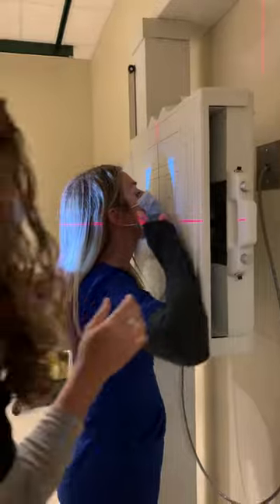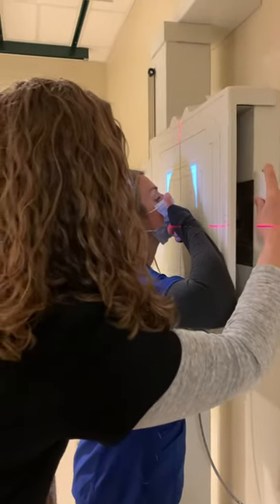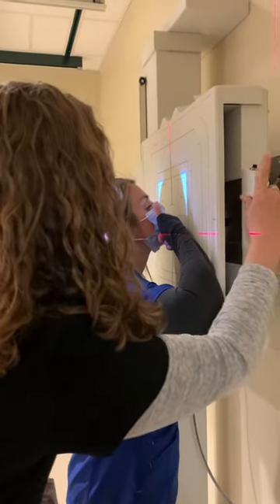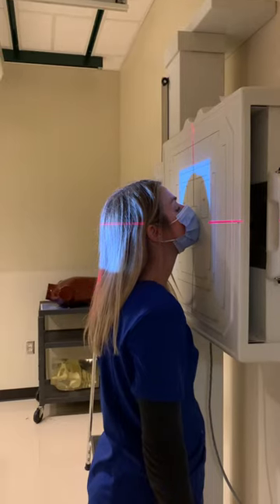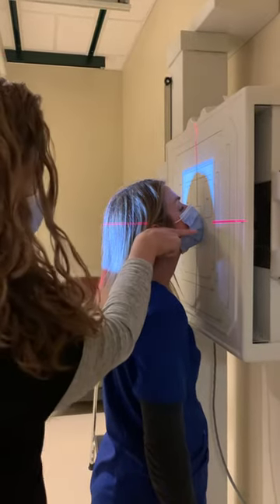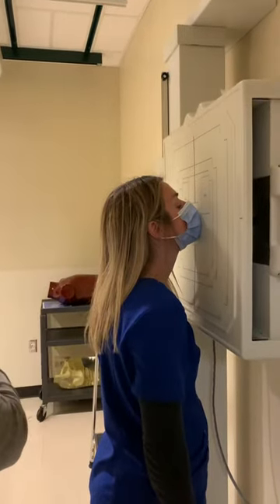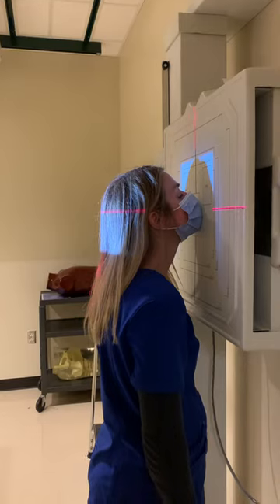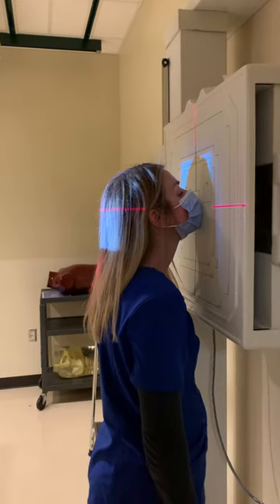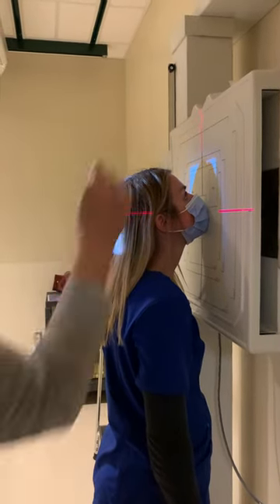We need our OML at 37 degrees to the image receptor, which will put your MML perpendicular to the IR. The central ray is perpendicular, and we're going to exit at the acanthion.